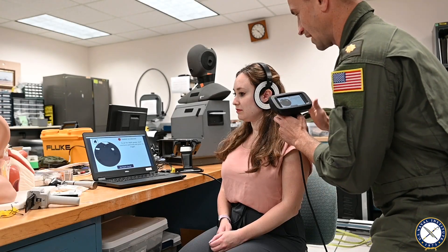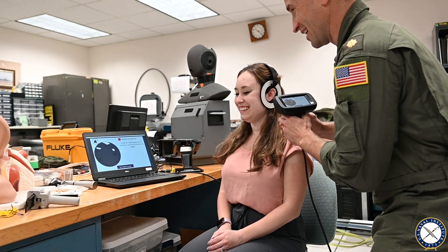The process for making custom hearing plugs has a lot of limitations, and 3D scanning is one of the first steps to address those limitations. The physical impression process takes about 15 minutes on average — about five minutes to set the impressions and then ten minutes for them to harden so you can take them out of the ears. The scanning process takes about ten minutes.